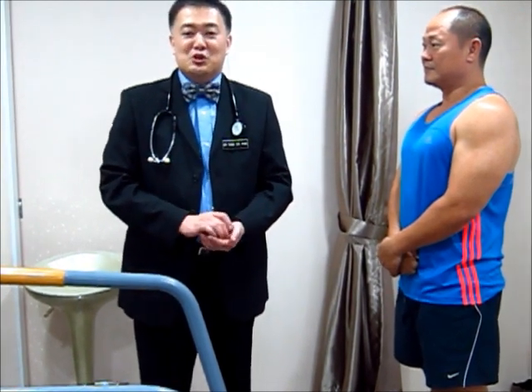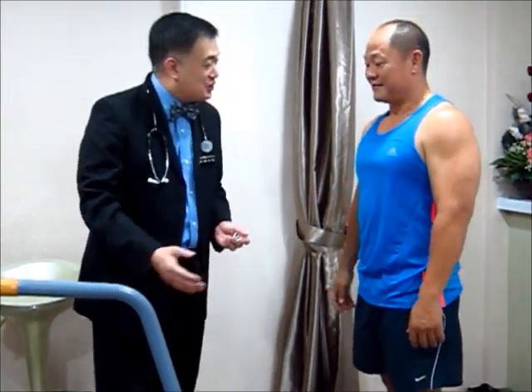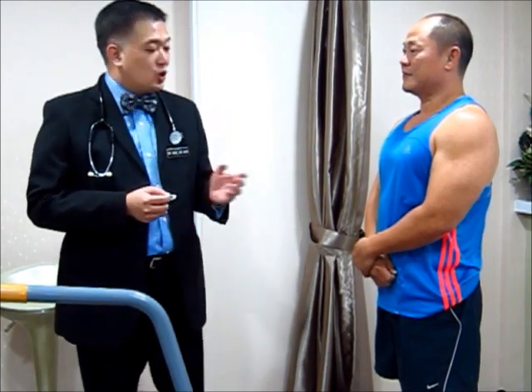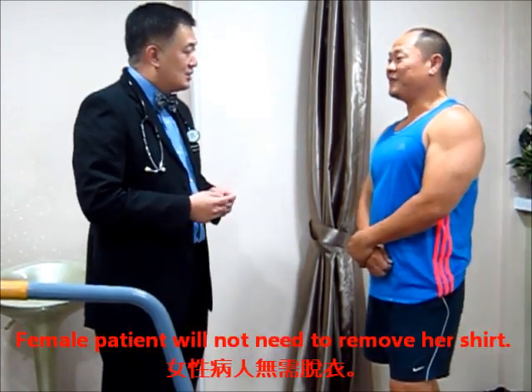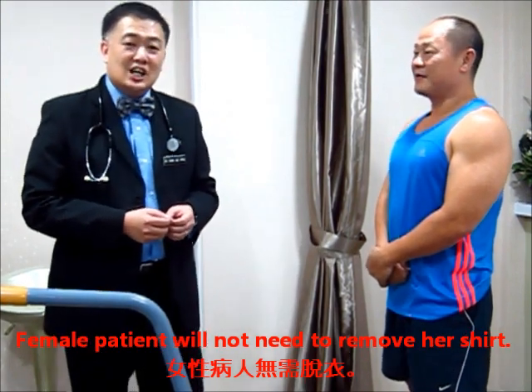First, I normally greet the patient. Mr. Koh, how are you today? I'm going to do this treadmill for you. For male patients, I normally give them the option whether to take off the shirt or leave it on. In this case I ask Mr. Koh if he wants to take off his shirt — it's easier to place the electrodes with the shirt off, so I ask the patient to remove his T-shirt.